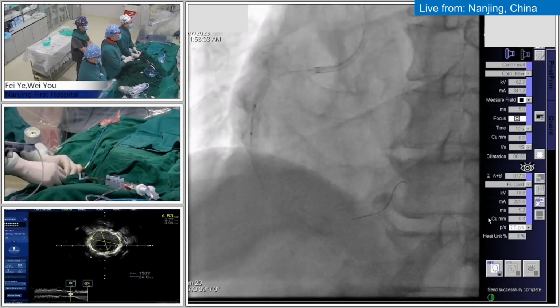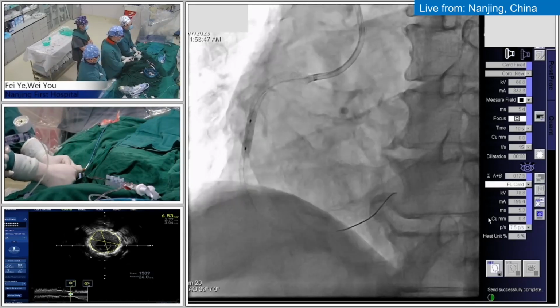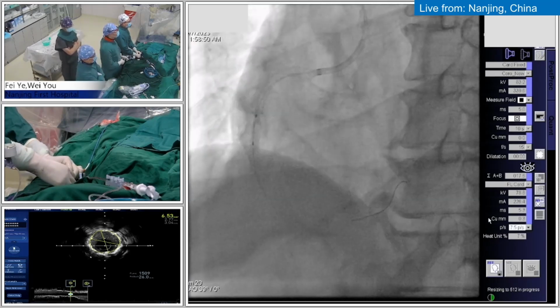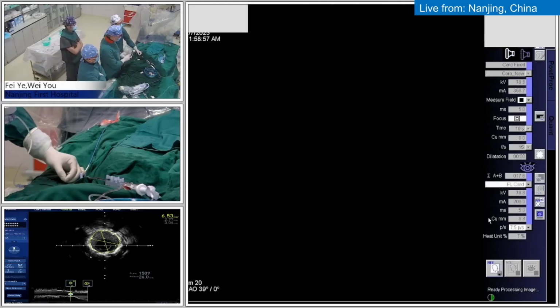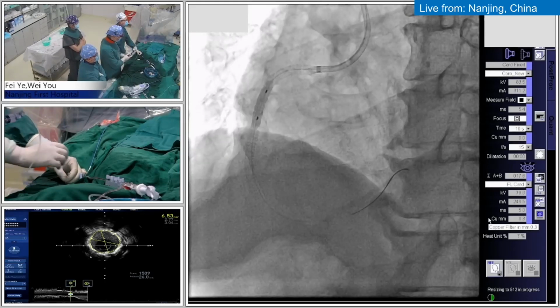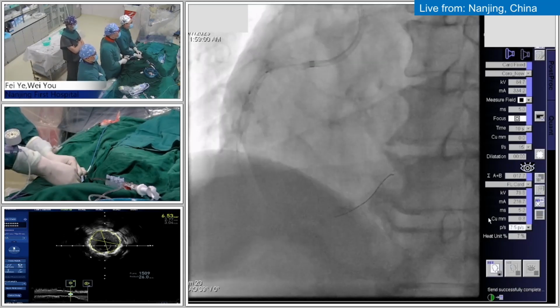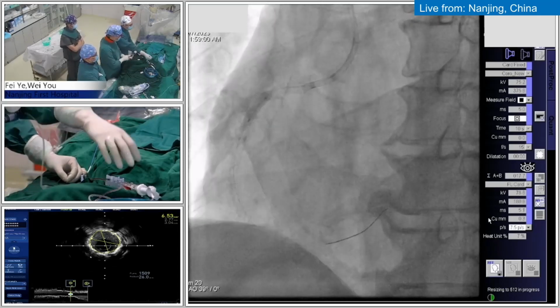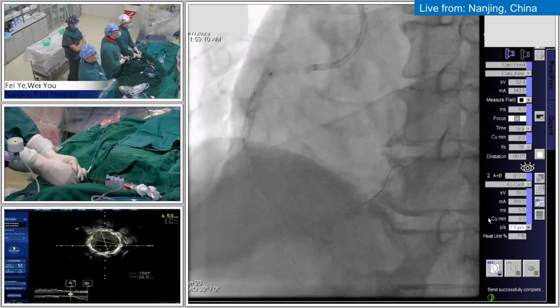Please go 20. 20. Okay, done. 20, please. 22. Okay, done. Okay, 22. Okay, done. Okay, IVUS.